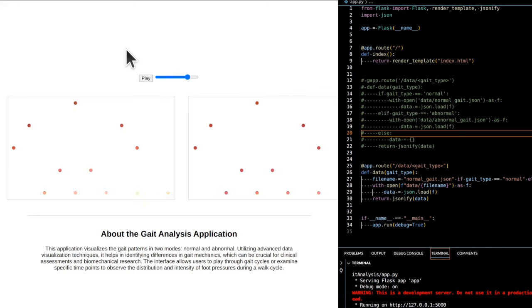Python code summary. 1. Defining foot outline. A set of coordinates is specified to represent the key points of the foot's shape, from the heel through the arch to the toes. 2. Positioning sensors. Sensor coordinates are defined based on anatomical knowledge of pressure points in the foot. 3. Creating smooth curves. Spline interpolation is applied to the outline points to generate a smooth, continuous curve that better represents the foot's shape for visualization.